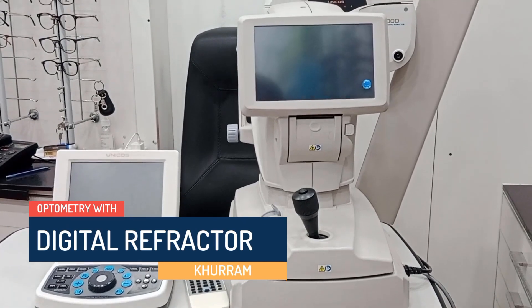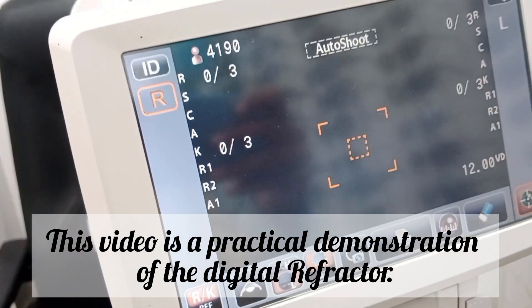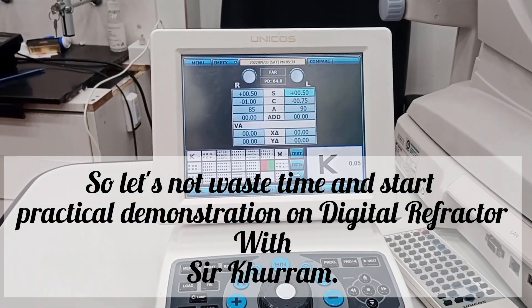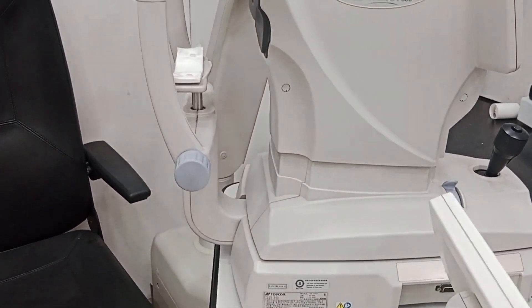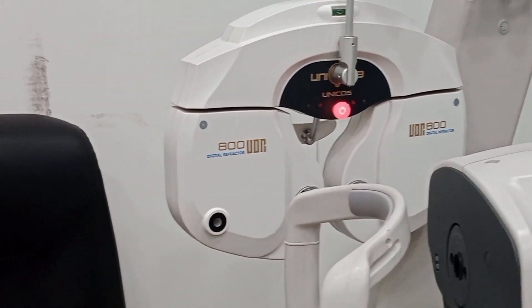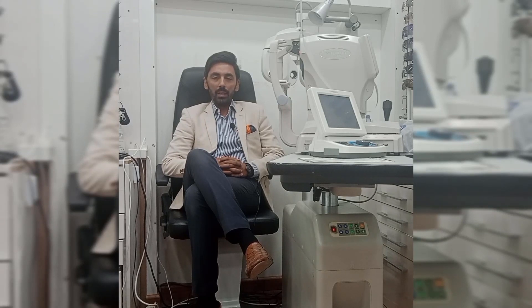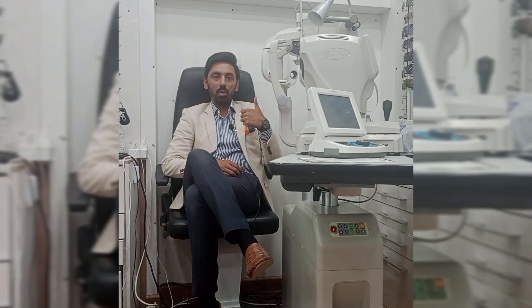This video is about the UNICOS UDR800 Digital Phoropter, also called a Digital Refractor. In this video we will learn how we can perform all the tests regarding subjective refraction on the digital refractor or the digital phoropter.